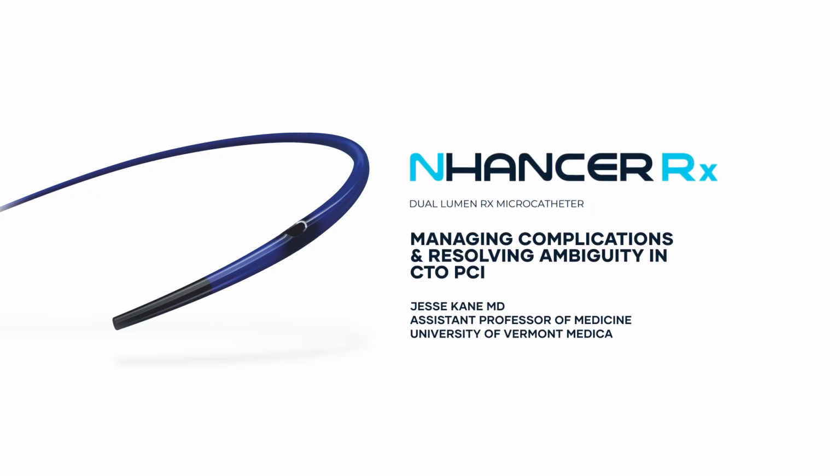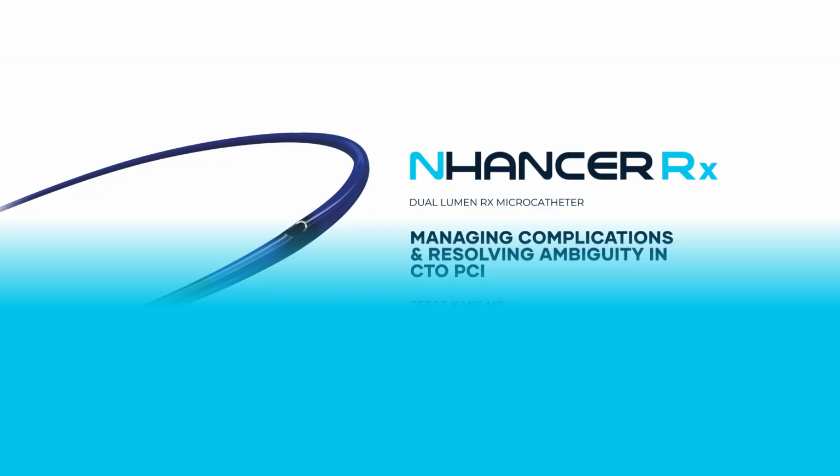Hi, I'm Jesse Kane, an interventional cardiologist at the University of Vermont. I'm going to be talking about the NHancer dual lumen microcatheter and its use in CTO PCI. Basically, a case where we use this to manage a dissection and resolve some ambiguity at a bifurcation in a right coronary artery.